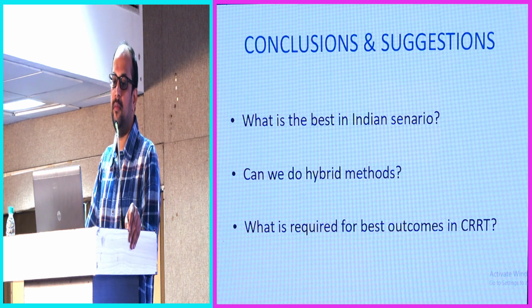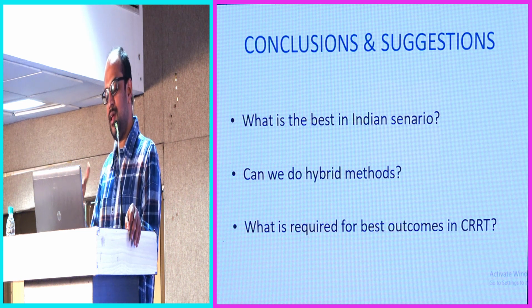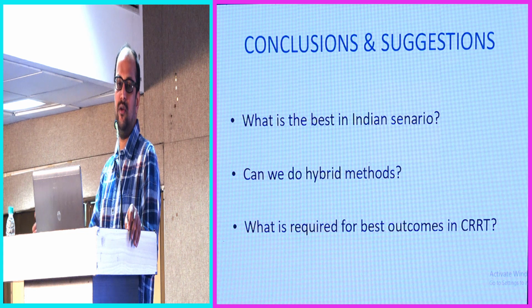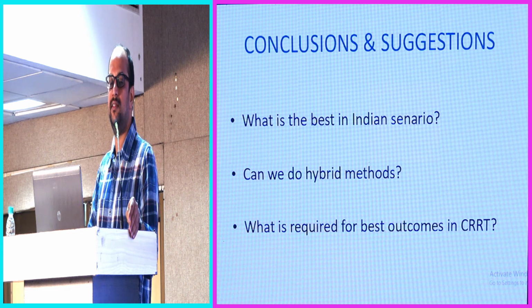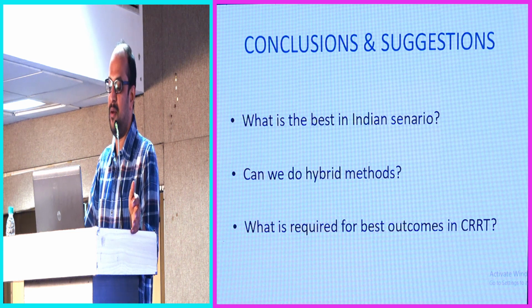At that point of time, the noradrenaline goes to 15 ml, 20 ml, and we consultants also feel a little bit shy to start citrate, because we know the patient is in severe shock, and we may not be able to convert the citrate to bicarbonate, because we are dependent on the patient's circulation, hemodynamic status, and a well-functioning liver to have a proper buffering agent.